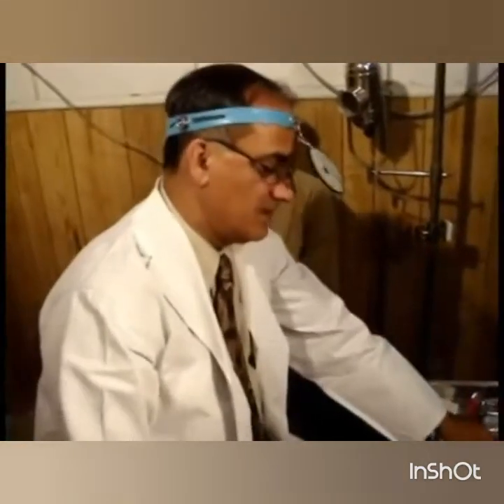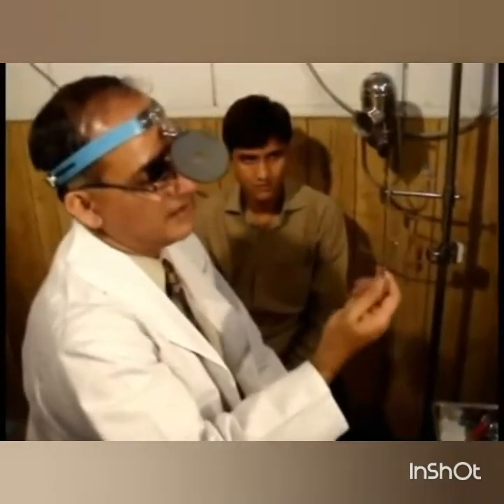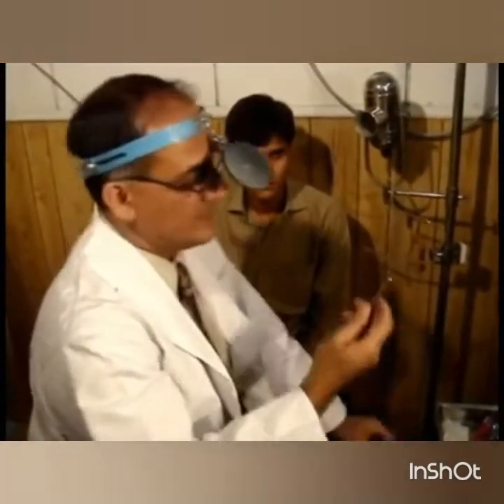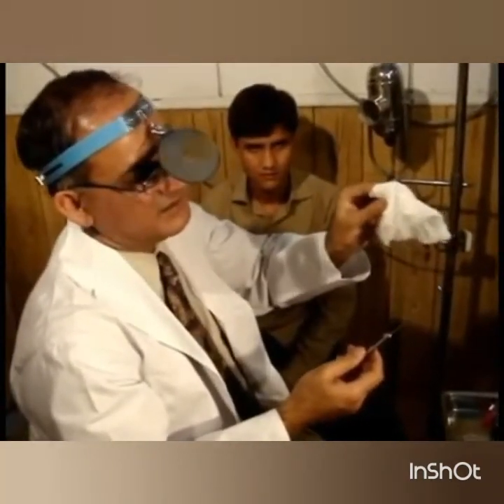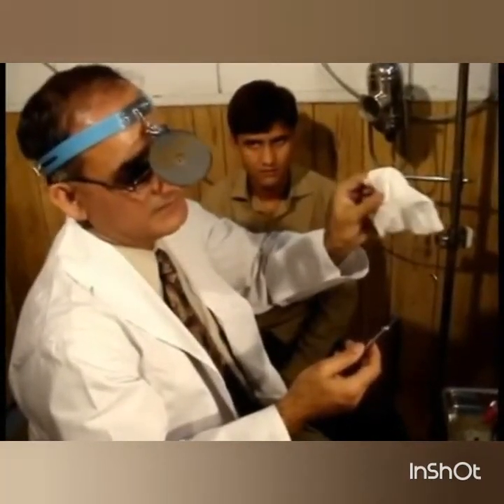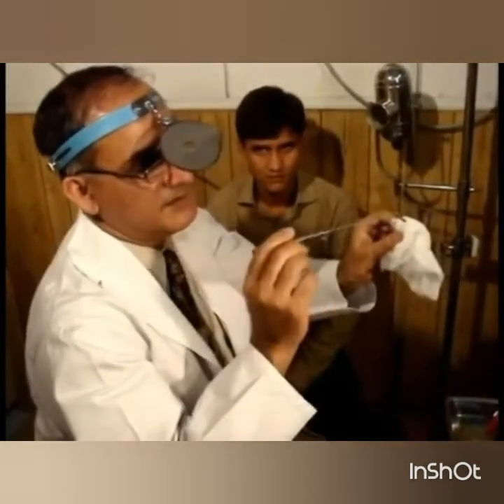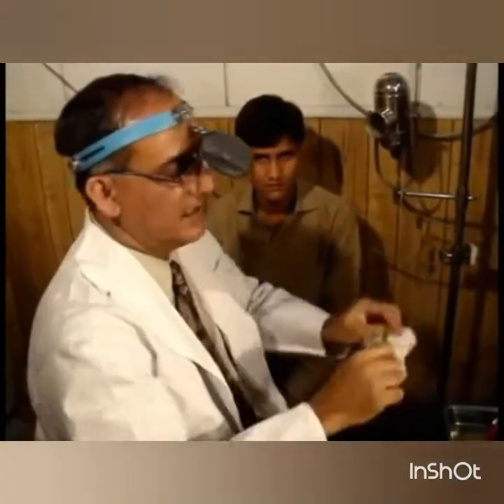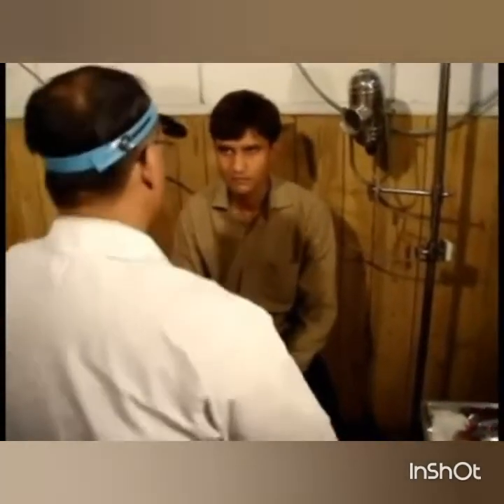Then for posterior laryngoscopy, indirect laryngoscopy, we use the indirect laryngoscope mirror, and we use this cotton square gauze. With the square gauze, we will hold the tongue, and with the help of this mirror, we will examine the larynx. We will demonstrate this in a minute. So we will start with the examination of the oral cavity and oropharynx.